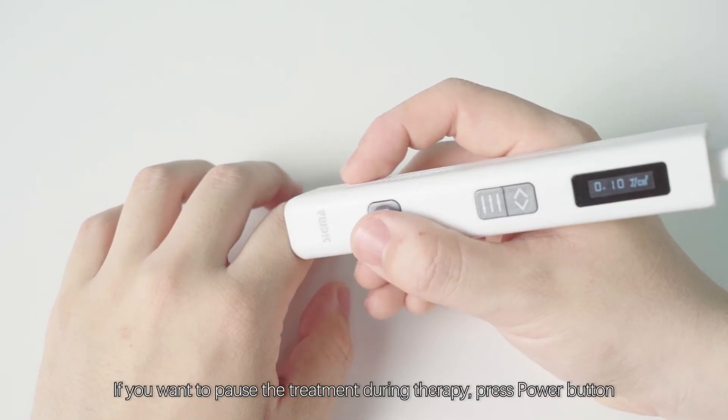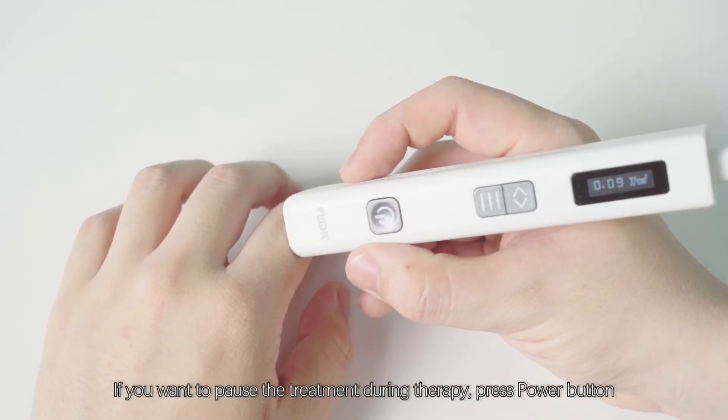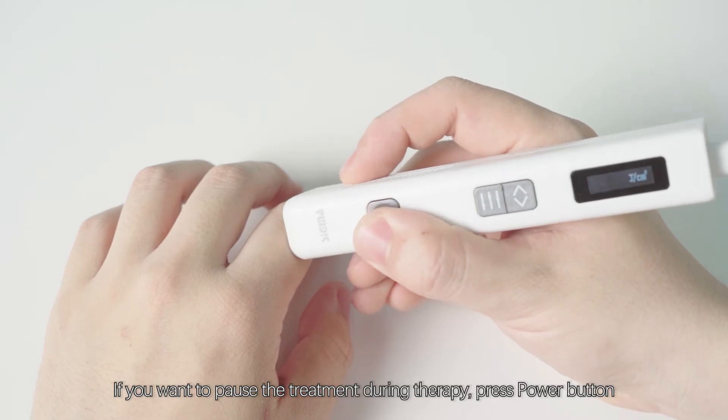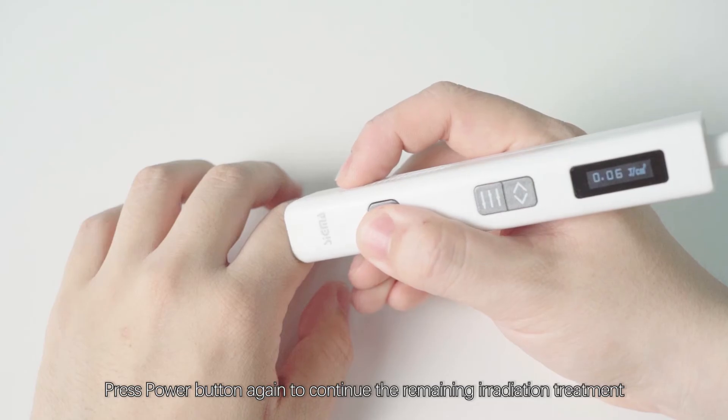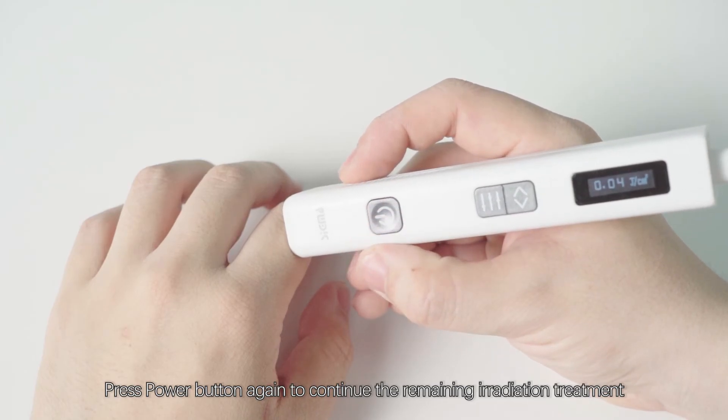If you want to pause the treatment during therapy, press the power button. The remaining dose value will flash. Press the power button again to continue the remaining irradiation treatment.